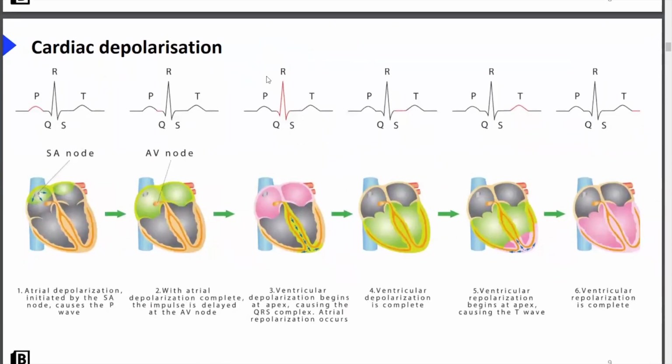Very good. So two things. The atrial repolarization is a small current, okay? On the ECG, the bigger the spike, the bigger the current. So the QRS is the biggest spike on the ECG because the ventricles depolarize with a large current or a large amount of charge, if you will. Atrial repolarization involves small flows of charge, small currents. And secondly, it happens around the same time the QRS complex is kicking off. So it just gets lost in the QRS complex. So you don't see it. The QRS complex just dominates it.